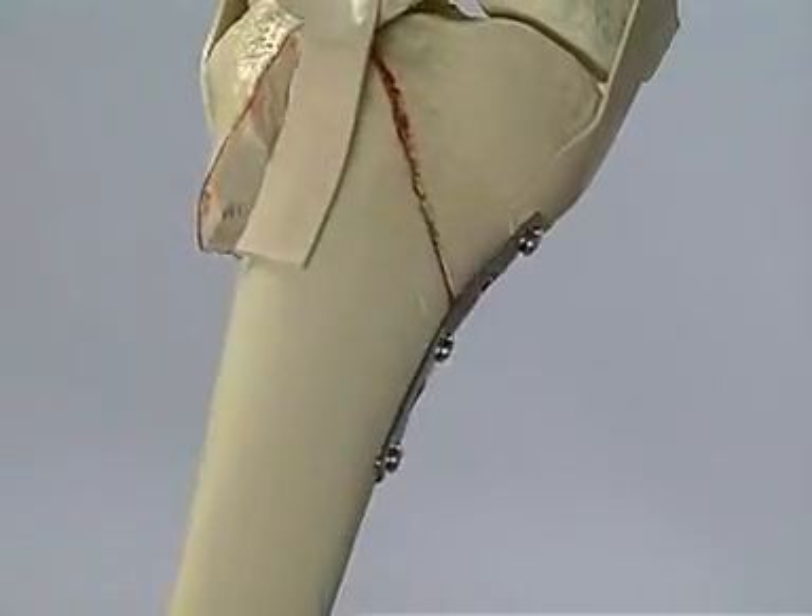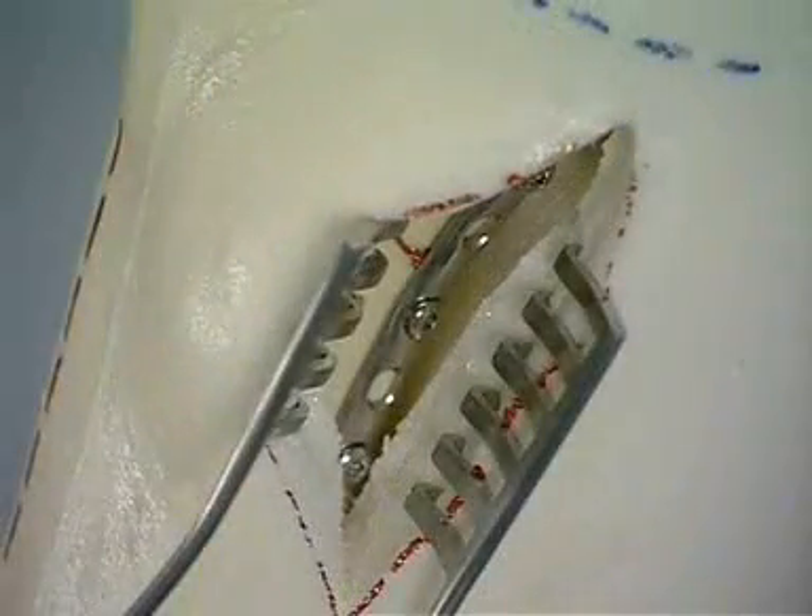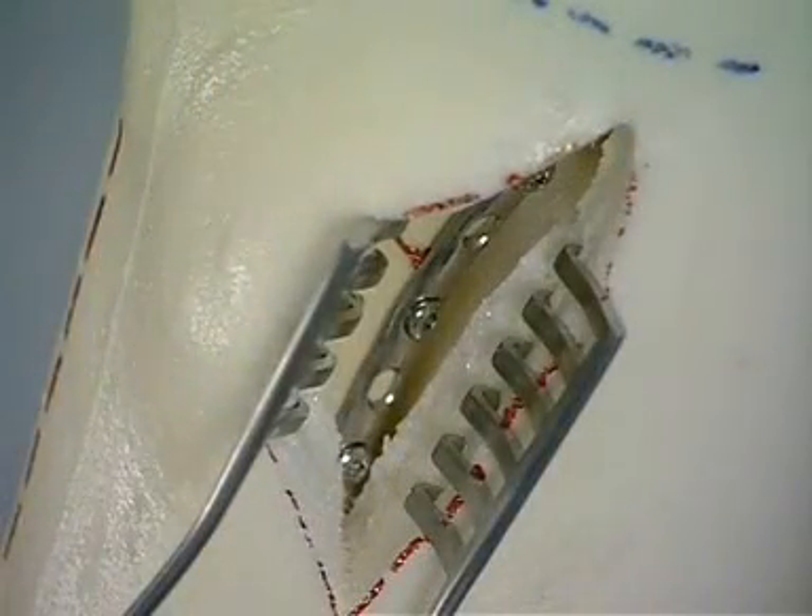In most cases, it is far simpler and less traumatizing to reduce the medial plateau fracture via this separate approach, rather than through the traditional anterolateral incision. At this point, an intraoperative x-ray control is advisable, as demonstrated in our clinical example with a preliminary fixation medially.